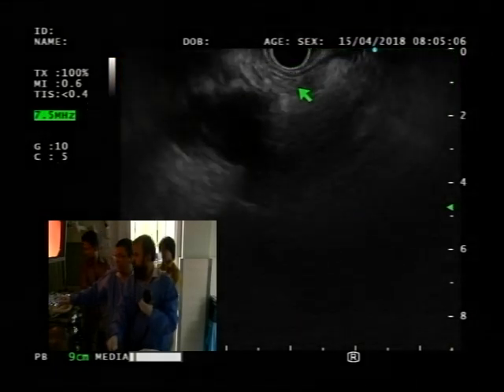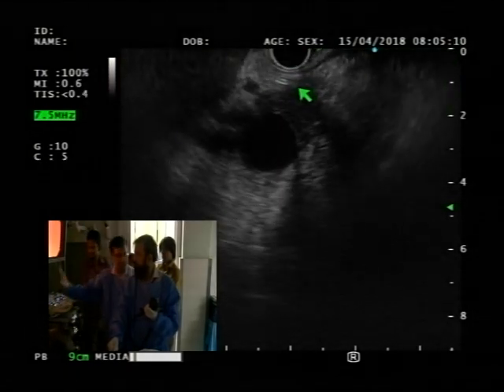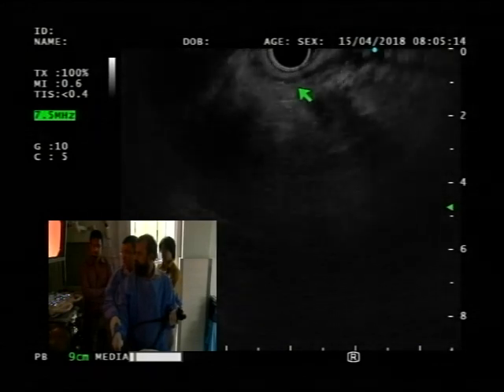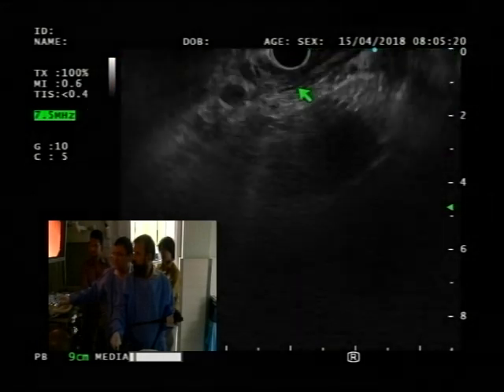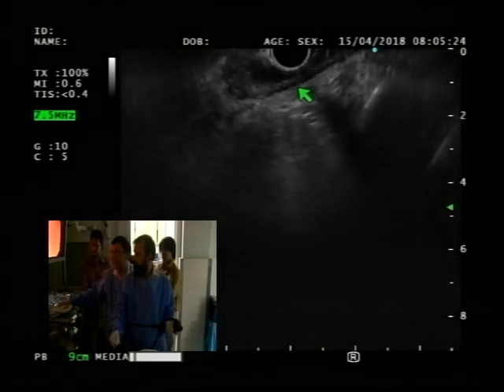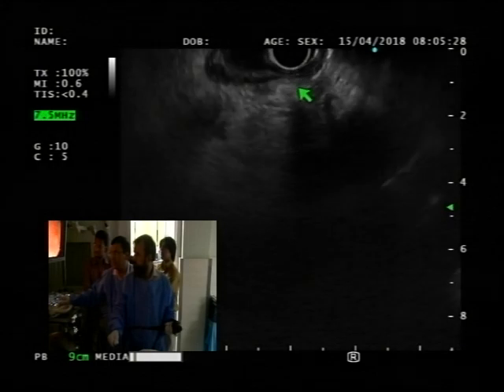Okay. You're lost again, right? Okay? Lost. So that's okay. You come back to the place where we started from. Find the aorta again. Find the aorta again. Aorta, please.